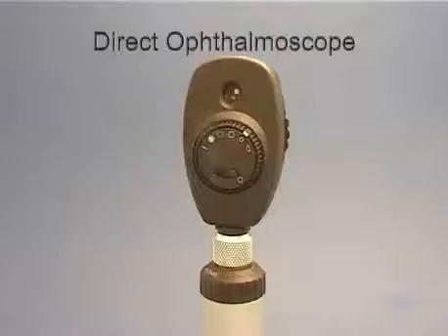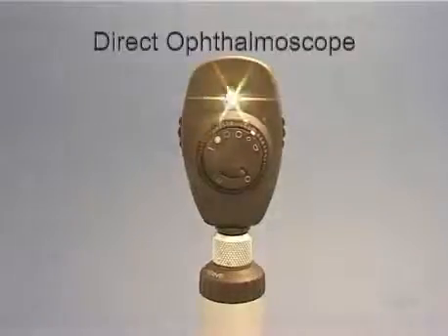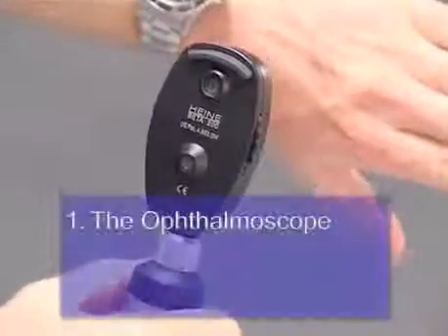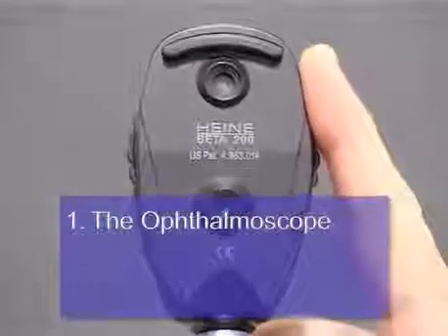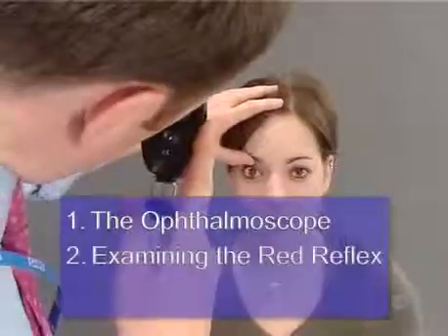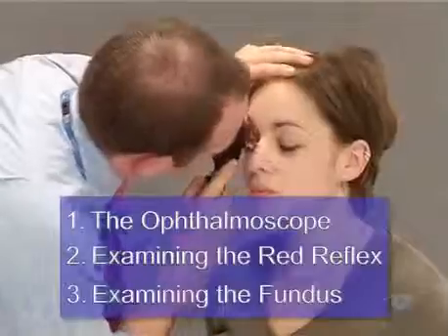The principal aim of this video is to teach you how to perform ophthalmoscopy using the direct ophthalmoscope. We're going to divide up this task into three stages. First, we'll show you how the instrument works and explain its controls. Next, we'll take you through how to set it up and align it so that you get a good view of the red reflex. And finally, we'll show you how to systematically examine the back of the eye, or ocular fundus.